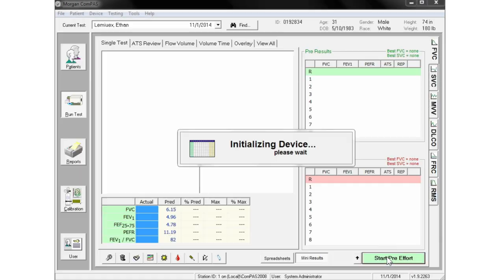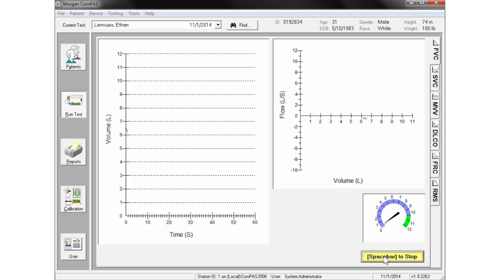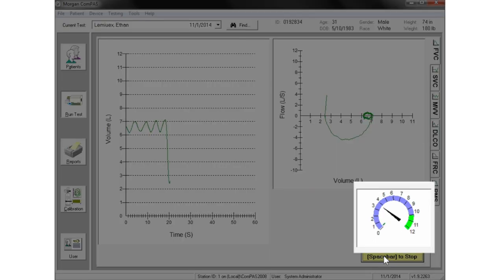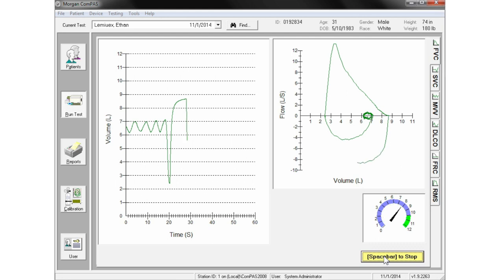Testing is initiated by pressing the spacebar and continues until the technician ends the test with another spacebar. To assist the technician during the flow volume effort, an FET meter counts the seconds of forced expiratory effort. The forced effort should continue for a minimum of six seconds, and in cases of COPD can be much longer.